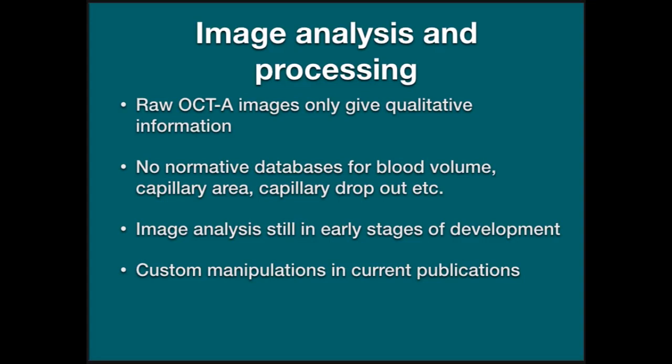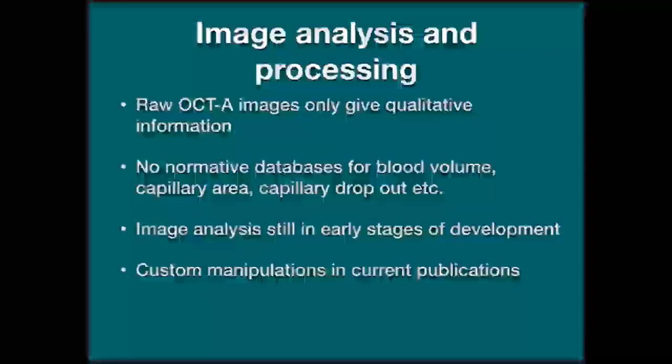You can go onto the internet and look at images from all of these OCT units that are in production or development, and you can see some beautiful images there. But if you look in a little bit deeper, you'll find that a lot of the images aren't produced with the OCT itself, but they've been manipulated afterwards with external software.